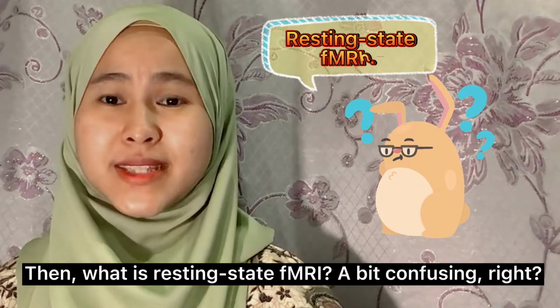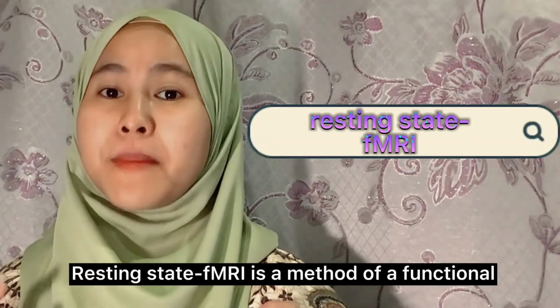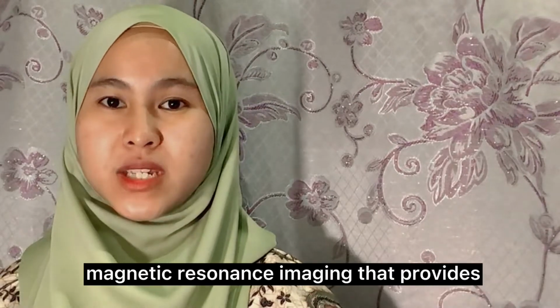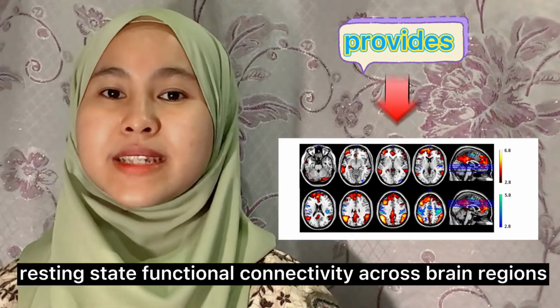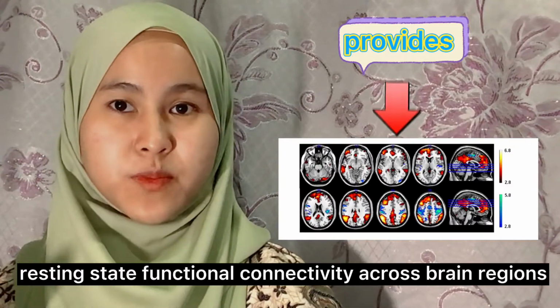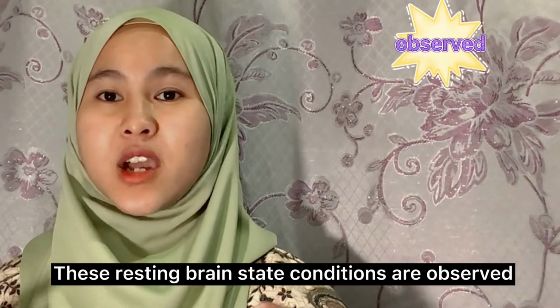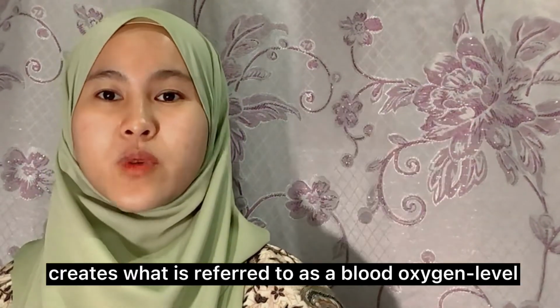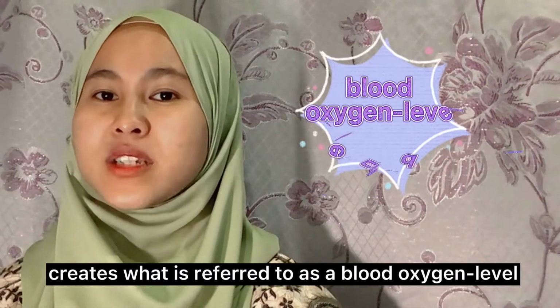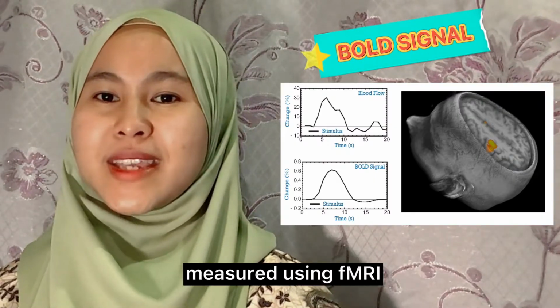Now, we already know about fMRI. Then, what is resting state fMRI? A bit confusing, right? Don't worry, let me explain. Resting state fMRI is a method of functional magnetic resonance imaging that provides a non-invasive method of assessing changes in resting state functional connectivity across brain regions in patients with Parkinson disease. These resting brain state conditions are observed through changes in blood flow in the brain, which create what is referred to as blood oxygen level dependent, or in short, BOLD signal that can be measured using fMRI.